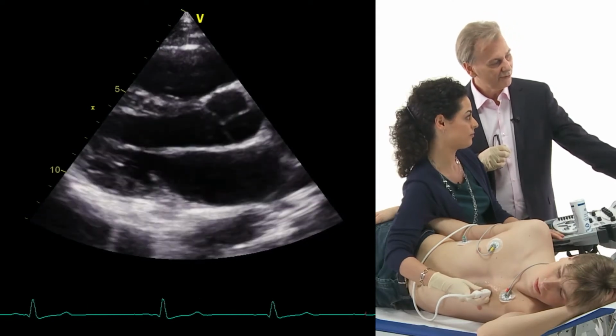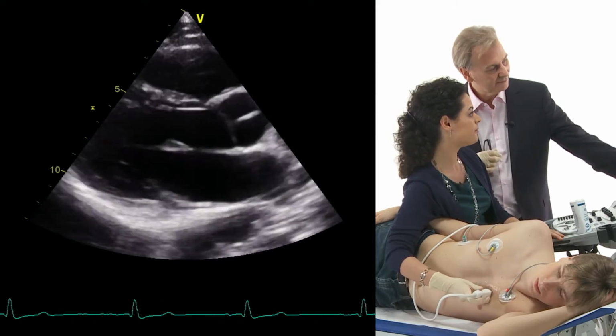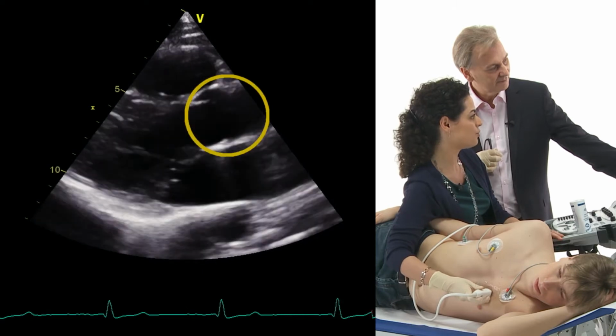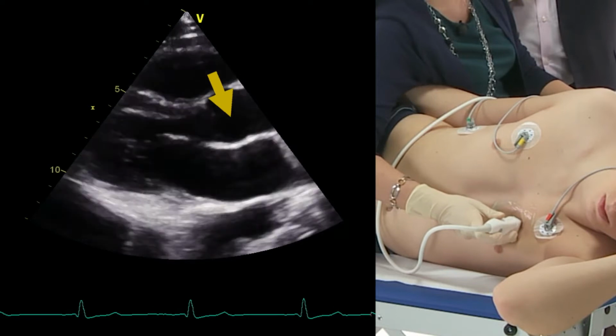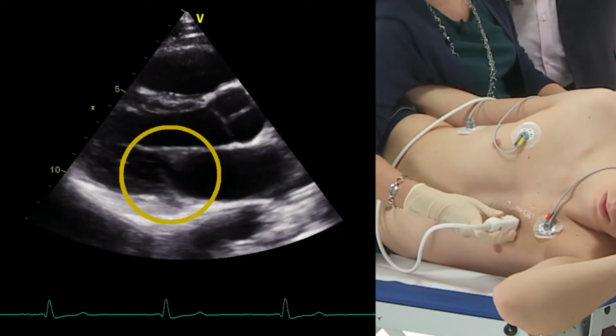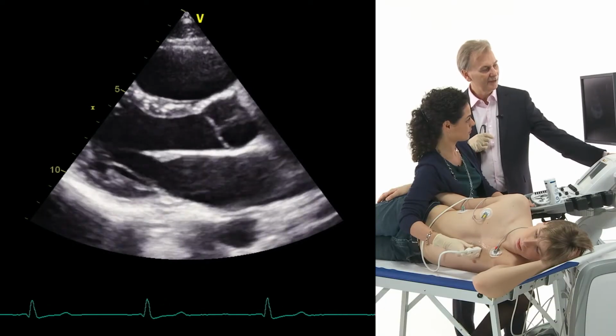So what are some of the structures we're seeing here? Or where is the aortic valve actually? The aortic valve we can really appreciate on top. It's the valve where we see two cusps and a line of coaptation, and the valve we see right below is the mitral valve. Okay, and there's another important structure that we can see here that we want to discuss in this chapter.